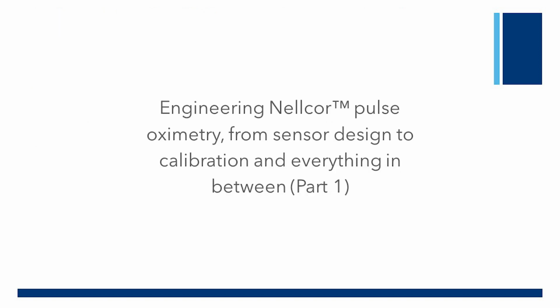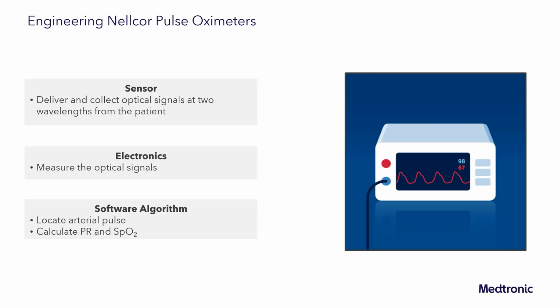For this introduction segment of the series, a discussion on the Nellcor technology. We will discuss engineering Nellcor pulse oximetry, from sensor design to calibration and everything in between. To help provide insight into this topic is Jake Dove, Senior Principal R&D Engineer at Medtronic.